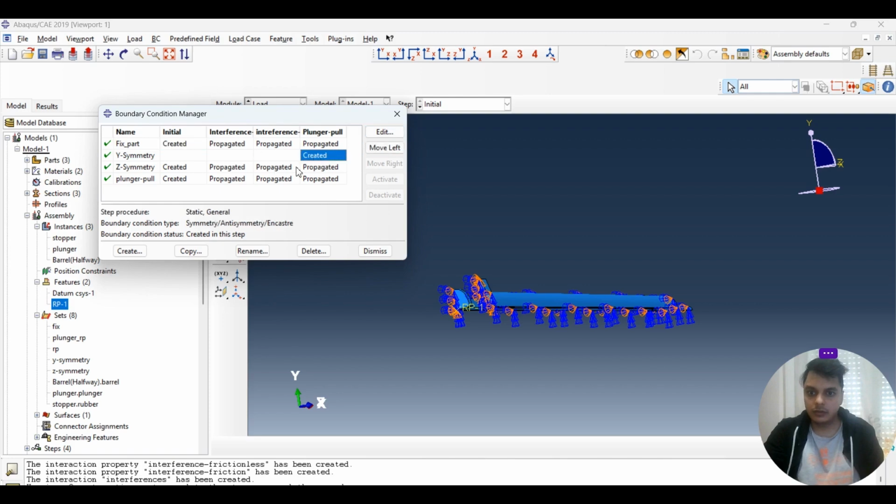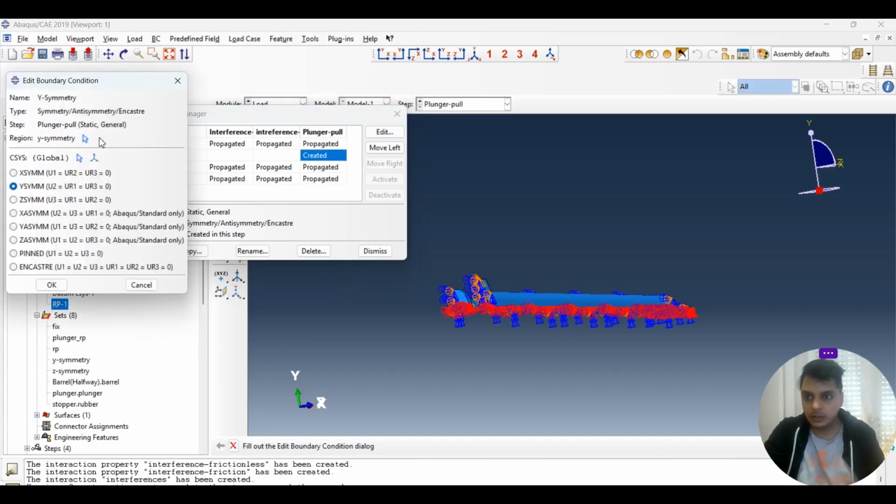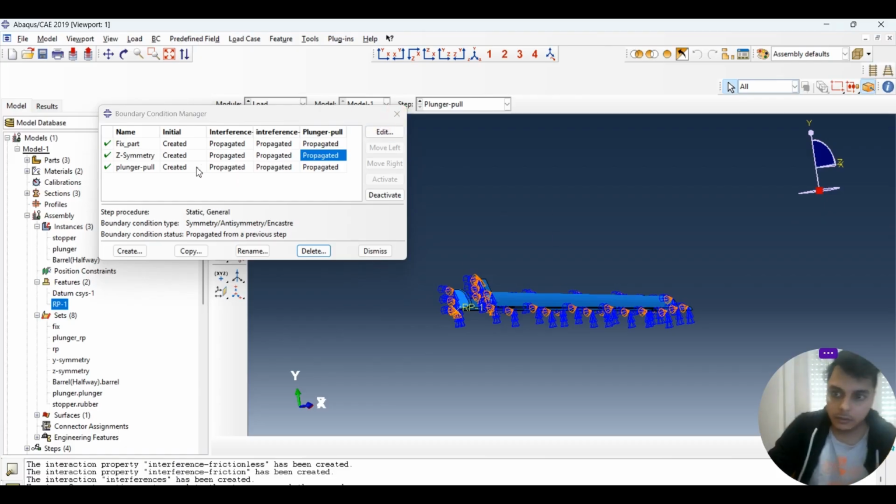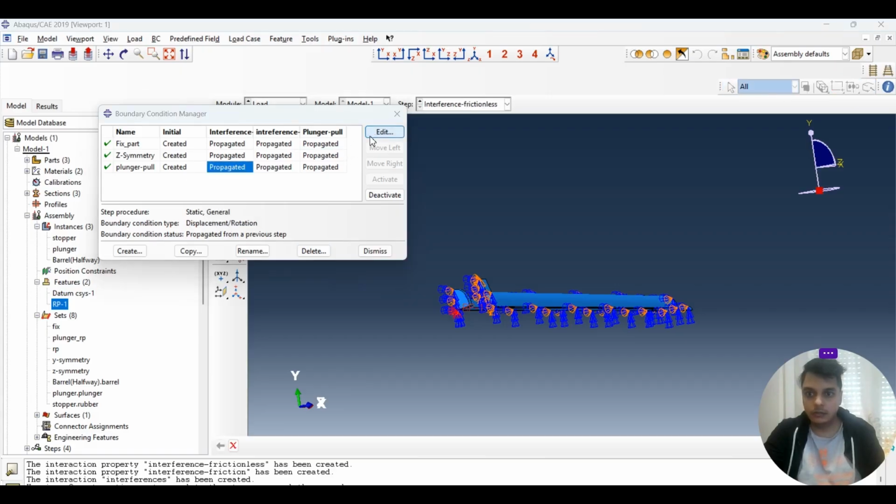Okay, so y symmetry is not defined correctly, so I need to define y symmetry again. So let's make it an edit, and I guess I have to redefine it on the initial step. So what we can do is just delete it here, and we will define it again. But before that, we have to define the plunger pull. So it's propagated. Everything is 0 here.